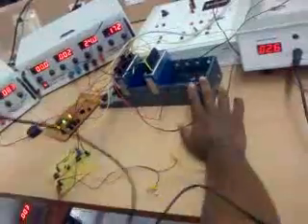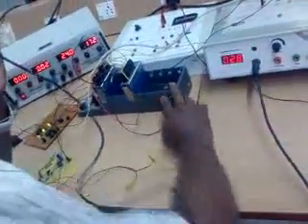This is the block diagram window. Here, from channel 0 the respiration rate signal has been acquired, and here you have a counting, here you have the pulse generation circuit, and that's displayed in the waveform. From the target device, there's a target.vi deployed, in which the counting code is shown, which I'll show after some time. From channel 1 you have the heart rate coming out, and channel 2 the pulse. And all these things are displayed over here.